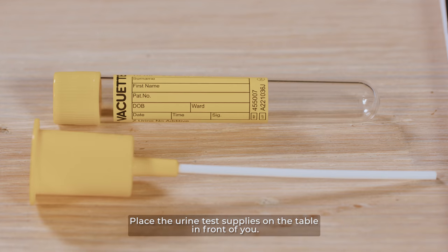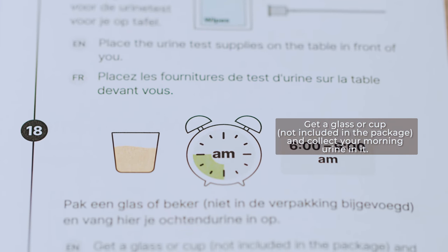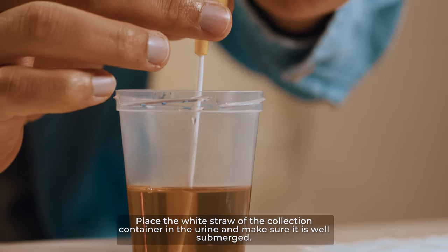Urine collection. Place the urine test supplies on the table in front of you. Get a glass or cup — not included in the package — and collect your morning urine in it. Place the white straw of the collection container in the urine and make sure it is well submerged.